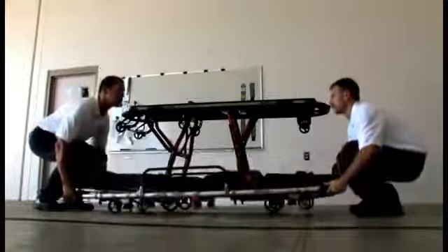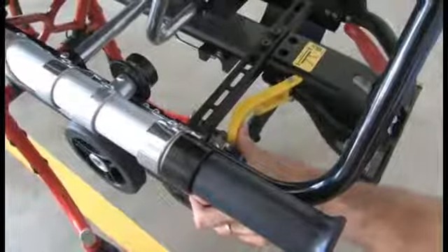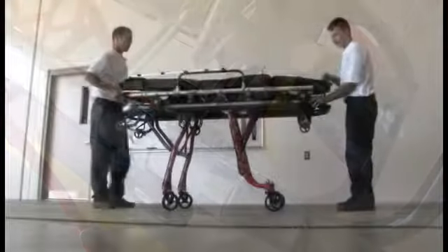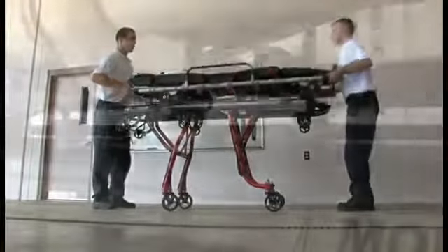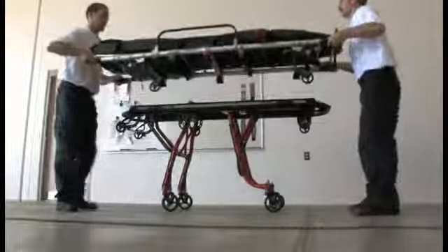Removing the stretcher top. To remove the stretcher from the transporter, push the yellow release lever forward and pull or push the stretcher toward the rear legs of the cot. When the stretcher is disengaged from the latch mechanism, you and your partner may remove it from the transporter.